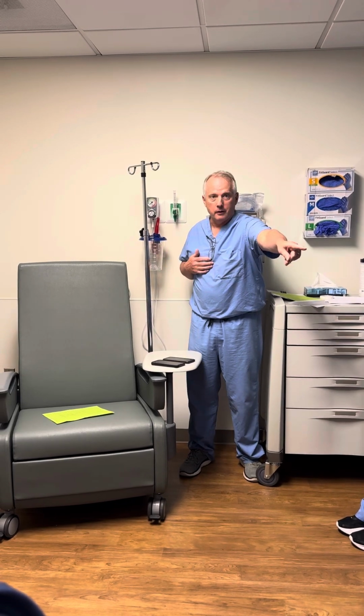Now, if it's local, do you necessarily have them on a monitor? Or is it just, we just do blood pressure and pulse?